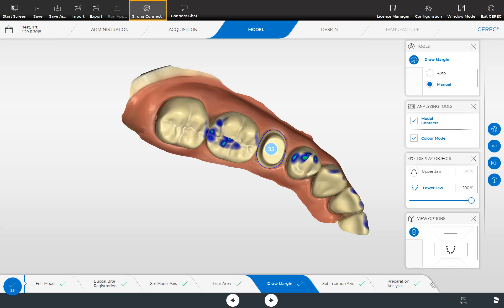By tapping Serona Connect, you can send the model data to your partner lab via the ConnectCase center portal, either for a design creation or for the final production of the restoration. Both parties need to have an internet connection as well as a Connect customer account. You will find information regarding the export function in our video tutorial on the topic of Export Options with CEREC Software 5.